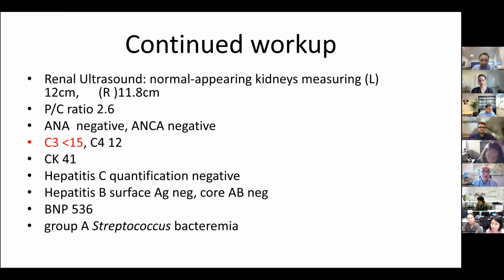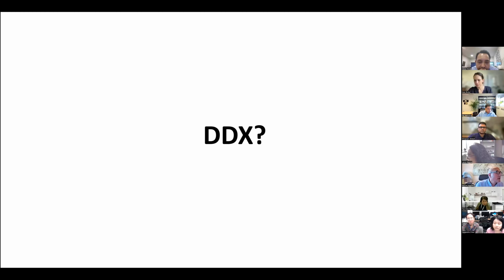I can see that. Okay, infection-related glomerulonephritis, very good. Immune complex glomerulonephritis, C3 GN spectrum, that is also very good. Okay, so those are two very good differentials. Anything else? Amyloid, history of IV drug abuse. That's a very common thing to see amyloid, especially in this region. History of proteinuria was relevant.